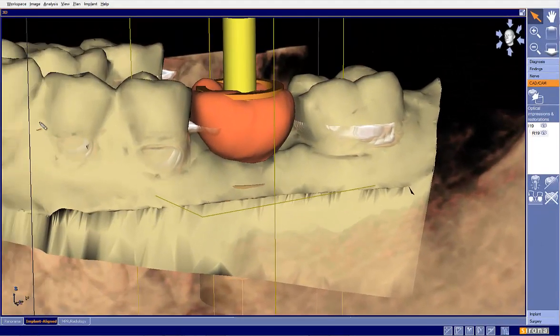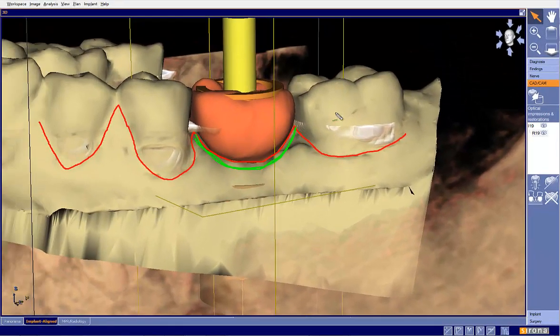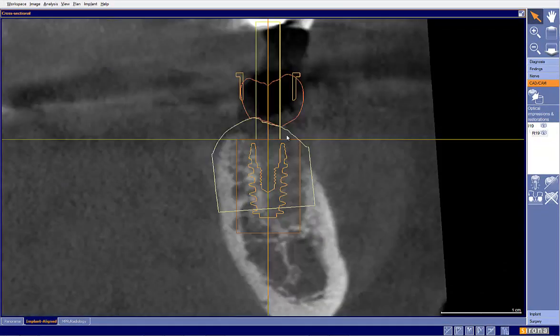And what I mean by that is, if we take a look at our gingival margins of our adjacent teeth and compare it to our implant gingival margin, we can see that our gingival margin should probably actually be more in line with this green line right here to better match the adjacent teeth. So in essence, a small error in the margin drawing will make it look here. So reality is that that tissue margin should probably be about right here.